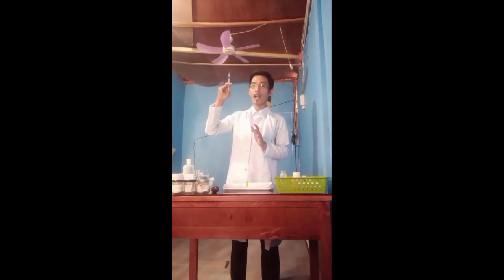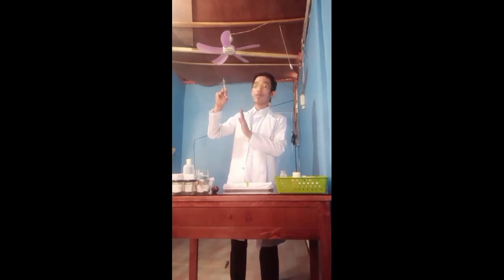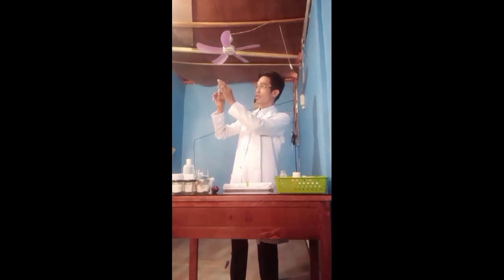So next is to expel excess air bubbles. Remove the needle from the ampule. Hold the syringe with the needle pointing up, just like this. Tap the side of the syringe to cause bubbles to rise toward the needle. Draw back slightly on the plunger and push the plunger upward to eject air. Do not eject fluid, okay? Remember, do not eject the fluid, only the air or the bubbles. So just like this. Okay, there's no air already.